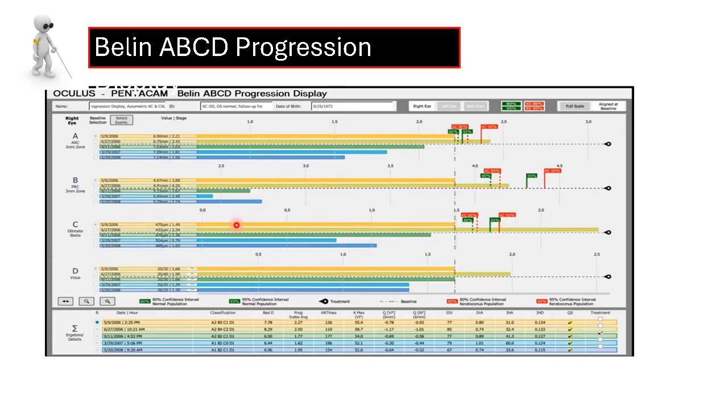unlike the Kmax, independent of the Kmax or pure changes in the anterior surface, because the Kmax is a very poor predictor as well as an ineffective parameter to document progression, because to document the changes in the Kmax, you need to have significant changes in the anterior surface of the cornea. By that time, the patient will have an advanced disease. So Kmax is not a good predictor of the progression.